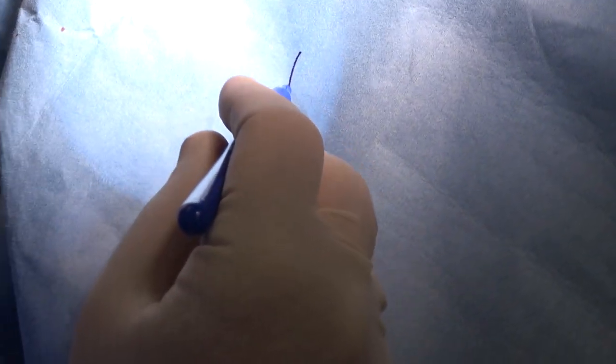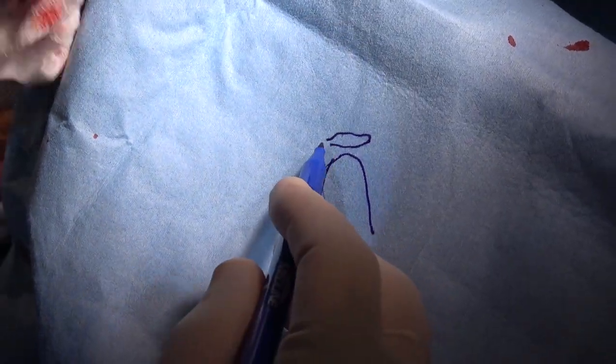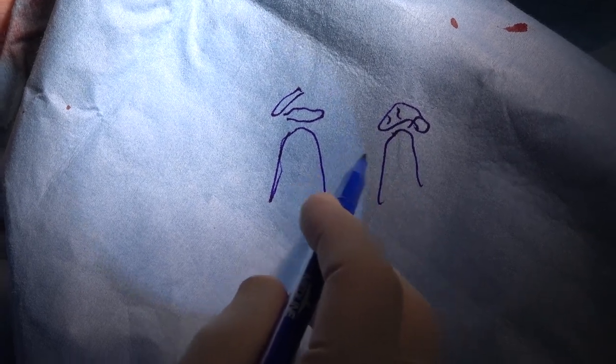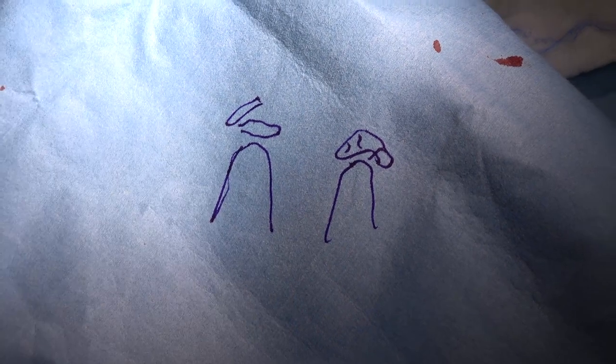Give me marking pen. So now if we imagine this cross section in the dorsum like this, the graft will not sit like this. If it sits like this, it might in the future warp like this. So the graft is going now to sit in this way, because we have done all the cross hatching. This will reduce significantly the possibility of the warping of the graft.